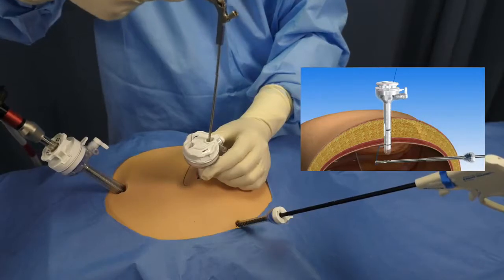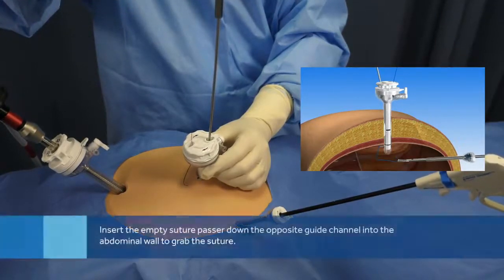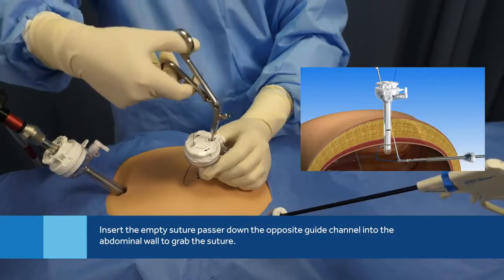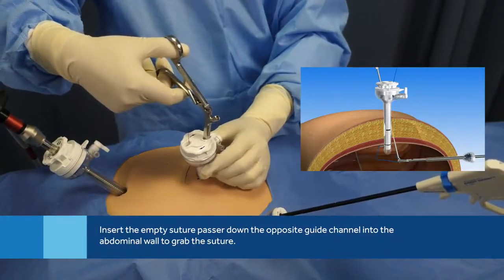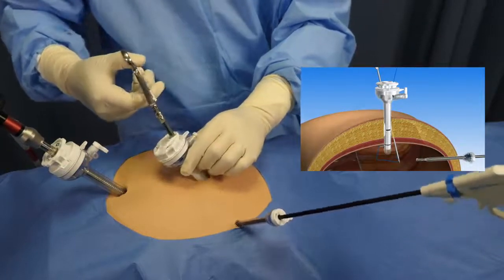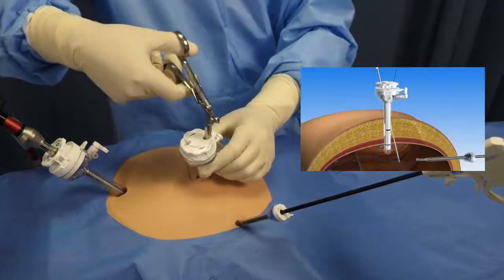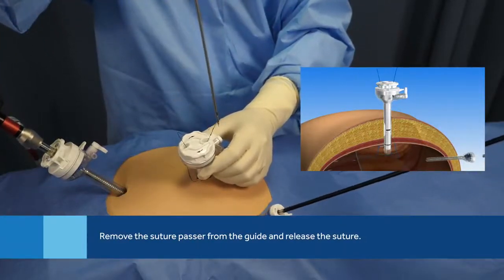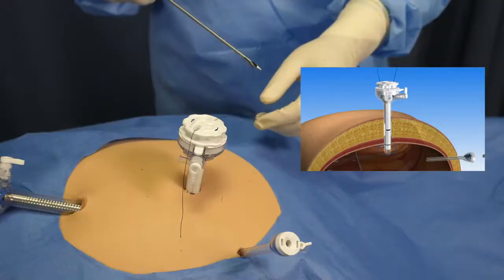Use a grasper to secure the suture before removing the suture passer while holding the cannula in place. Keep hold of the cannula to ensure it's still lined up with the peritoneum. Insert the empty suture passer down the opposite guide channel and into the abdominal cavity. Using the grasper, place the suture into the jaws of the suture passer. Close the jaw and remove the suture. Once the suture passer is fully removed from the guide, release the suture.